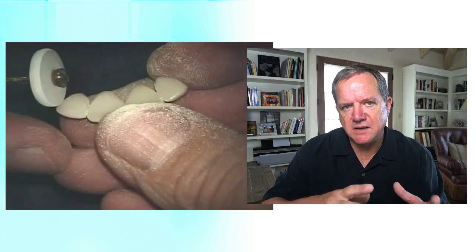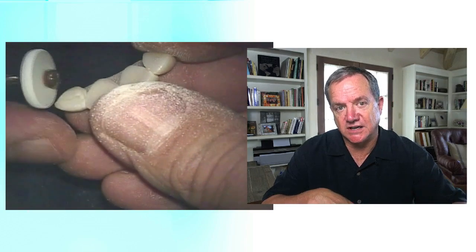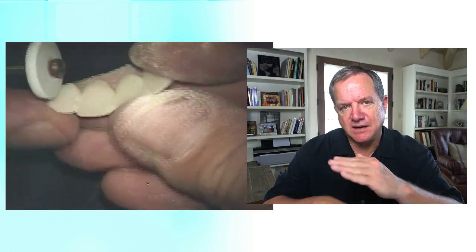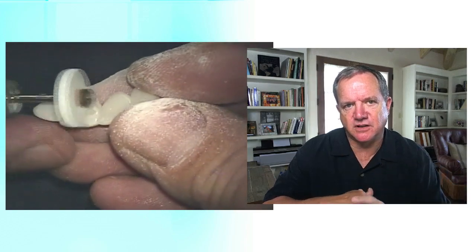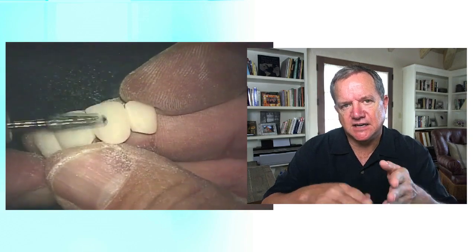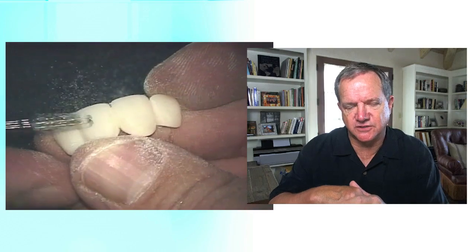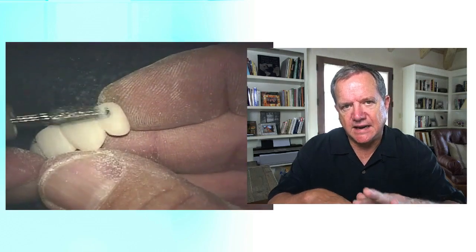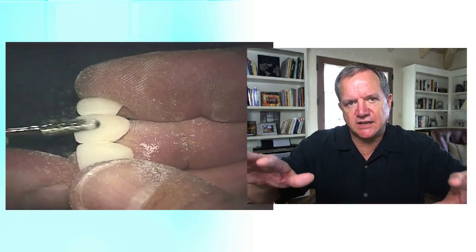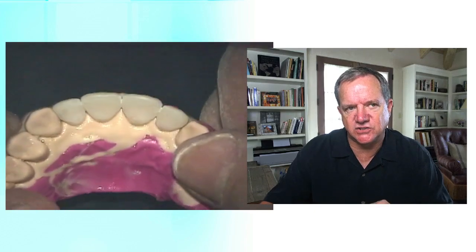There's a gray pre-polishing wheel. It's a rubber wheel from Brasseler I'm using to put the concavity in the lingual surface, straight lab handpiece. I'm also using it to put that bevel on the incisal edge. And then here's that medium carbide, and I'm using it to put concavity, if you will, the lobes in the facial surface. So I then create that same carbide and I move it back and forth to kind of gently spread those lobes out so they're not distinct little indentations.